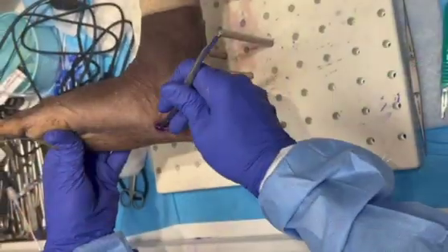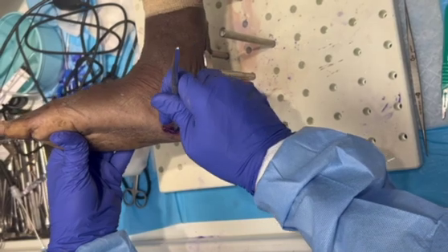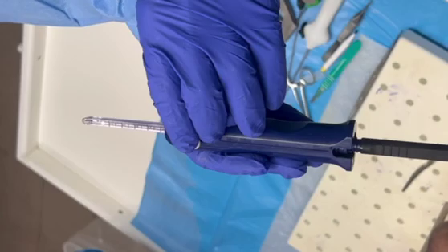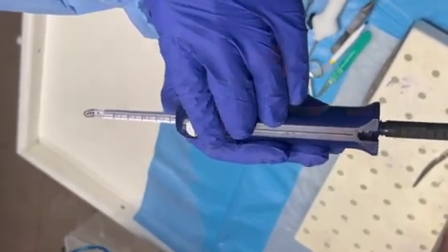The dilator is then introduced and gently advanced plantar to the medial aspect of the fascial band to create a portal and potential space for the 1.9 millimeter endoscope and the endoscopic center line release device. The needle scope is then introduced into the release device. The plantar fascia can be viewed utilizing the needle scope.